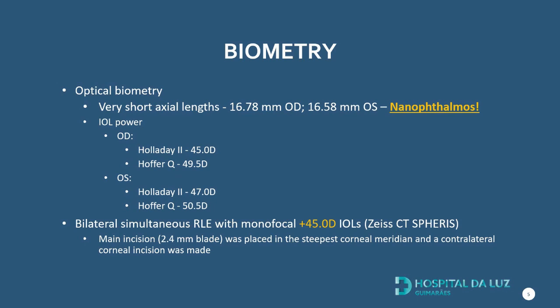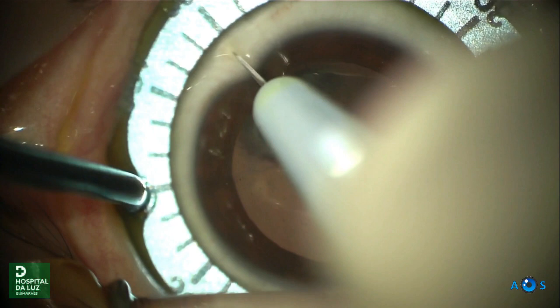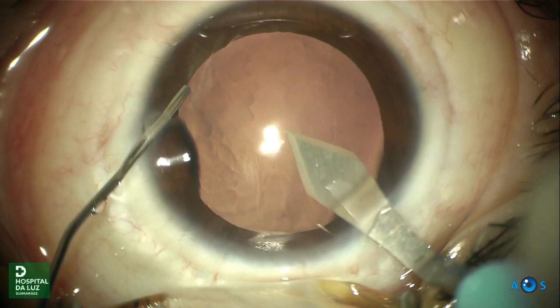We decided to perform bilateral simultaneous clear lens exchange, using a monofocal 45 diopters intraocular lens. We marked the steepest corneal meridian to use as the main incision and reduce astigmatism, and performed capsulorhexis carefully to avoid a radial tear, since the anterior capsule is more elastic in young patients.